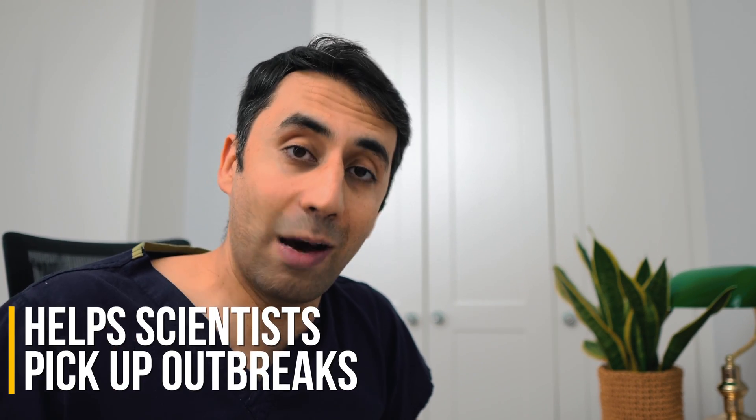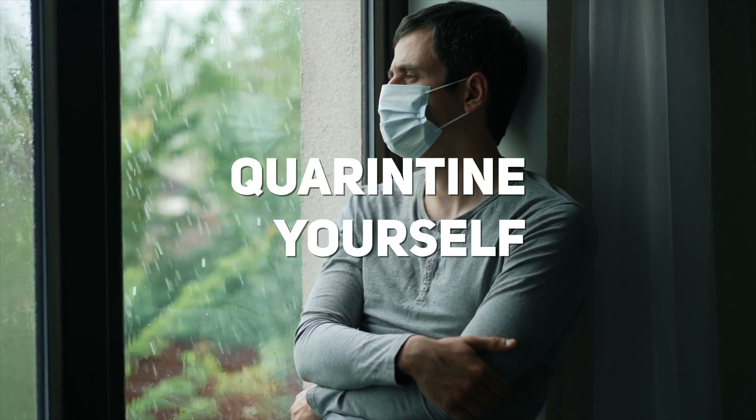Have a look at the leaflet, which has links to where you can record your results — this helps scientists pick up new outbreaks. If you have a positive result, please follow the latest guidelines about self-isolation for yourself and also your household.